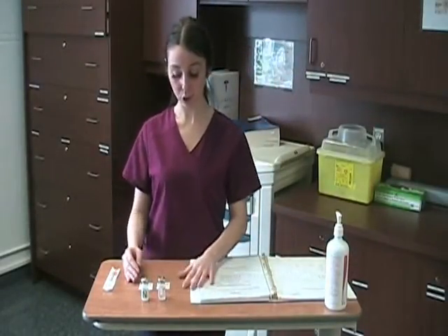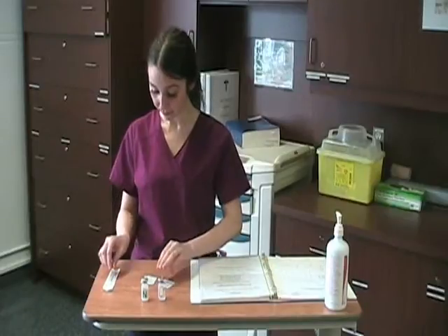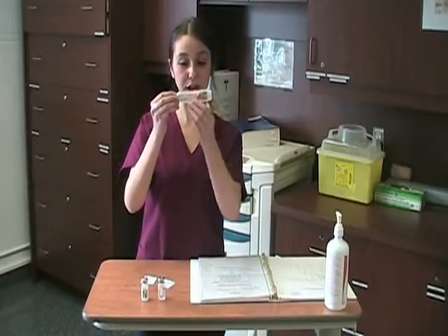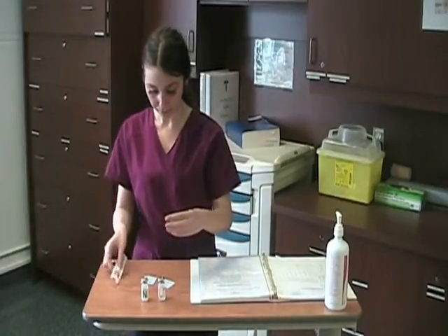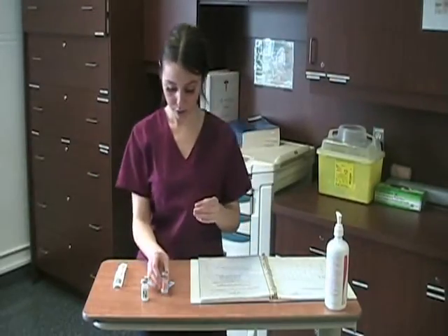The next step is to gather my materials. I have two alcohol swabs and a syringe. Always be sure to choose a syringe that's specifically for insulin — it'll be labeled insulin and marked in units, which is very important. And we have our two insulins: Humulin R and Humulin N.